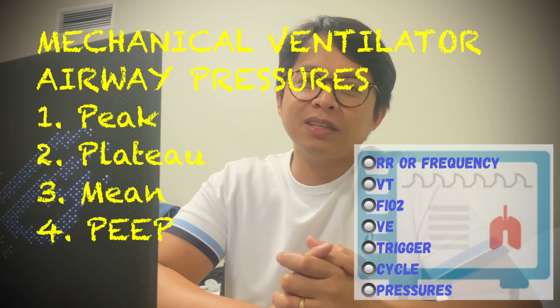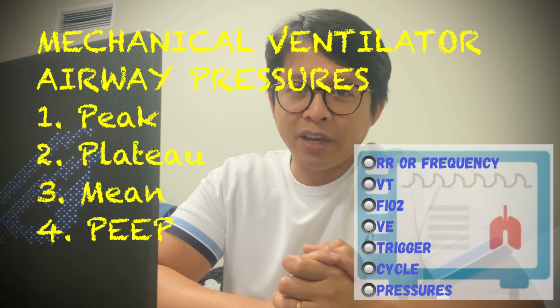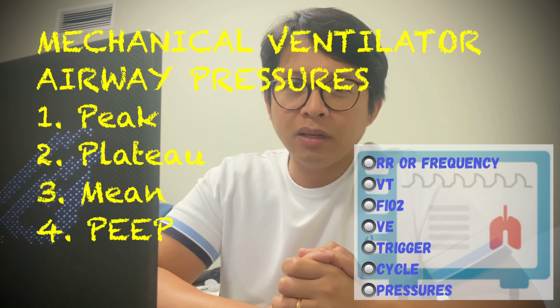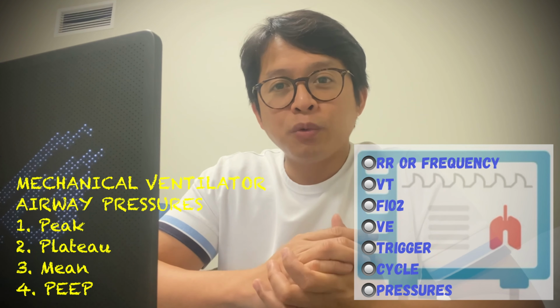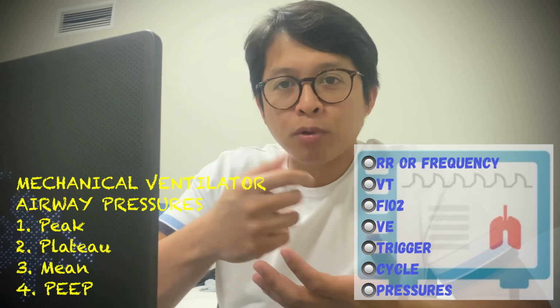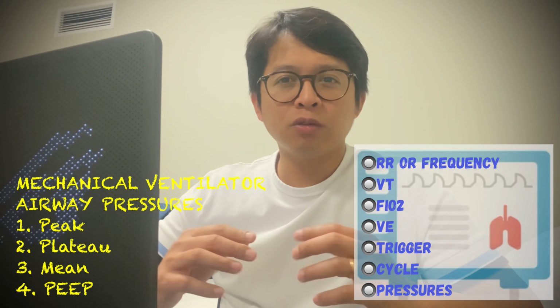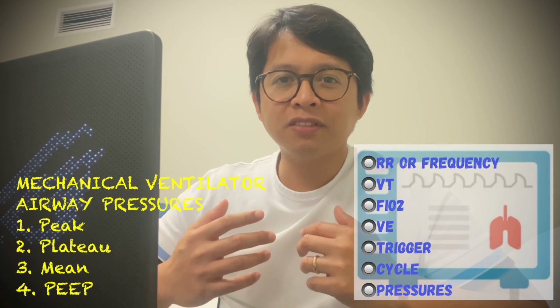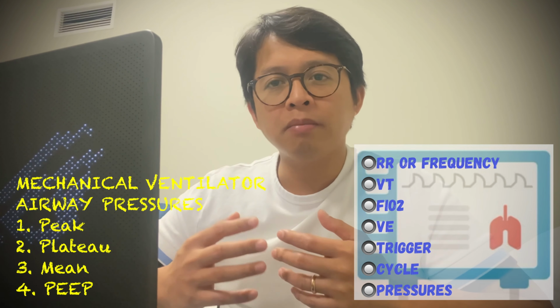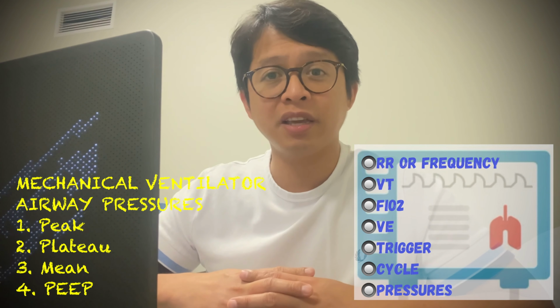Now, how about the PEEP, or the positive end-expiratory pressure? This is the pressure we set to prevent the alveoli from collapsing. Normally, the lungs do not collapse even after forceful expiration, because they are not empty no matter how forcefully the air is exhaled.